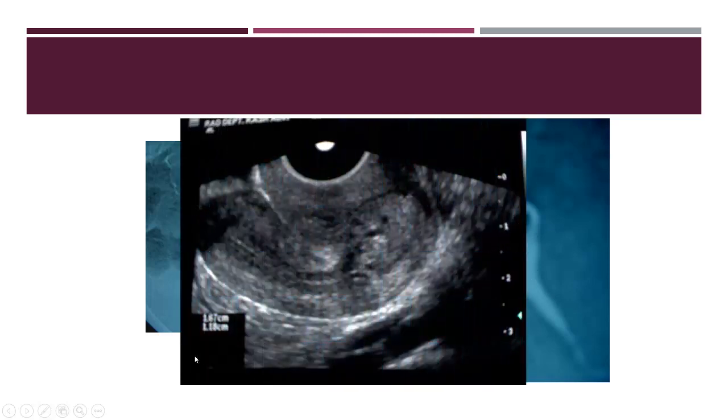In this case, they told me that the contrast is coming out and they could not do the hysterosalpingography. Here we put a very narrow dilator which can opacify the cavity, and on doing ultrasound there was a large cervical polyp.